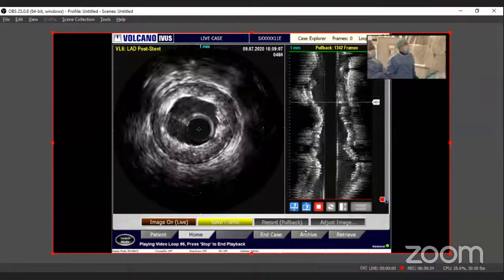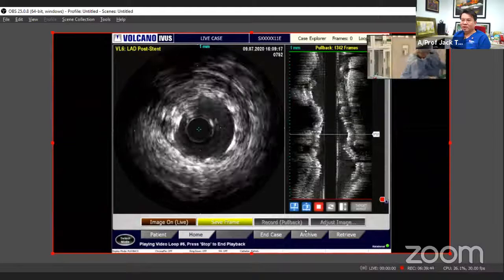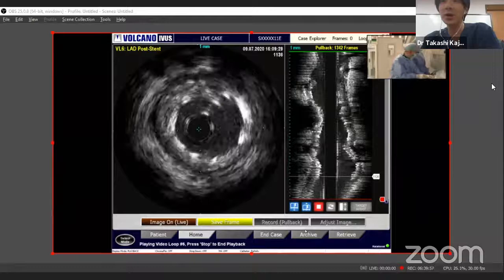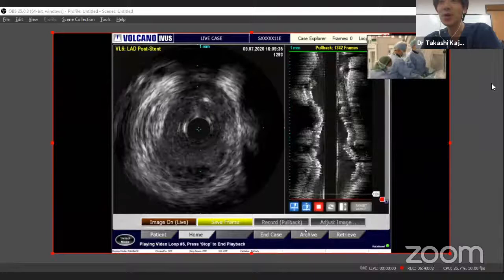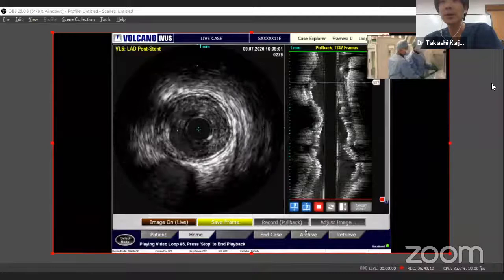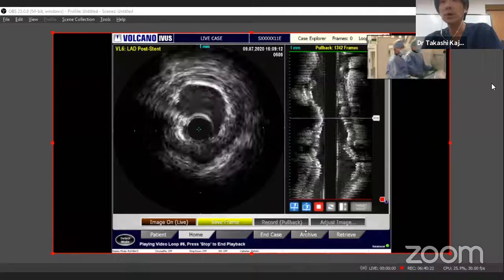Can I ask, in Japan, since they do a lot of imaging for this, is it necessary to really make sure you have a final IVUS on both branches? Yes, if possible, yes. But in this case, the angulation is very difficult to pass this IVUS. You may try a Terumo IVUS. Maybe it passes easily through this tight region or this angle. But in this case, apposition is good and expansion is also good. I think it's acceptable for this case.